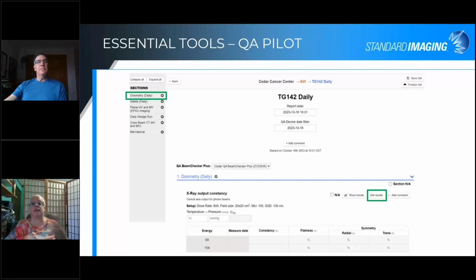That's a great question. So that data cradle is where you would put it on to recharge, but it's also the data cradle because we have the transfer of data. So what QA Pilot has is what we call the equipment hub. It's a small application running in the background, and it's a listener for new data. As it sees data, you can set up things in various ways. More or a bit less automated, but still very automated, to get that data into QA Pilot.